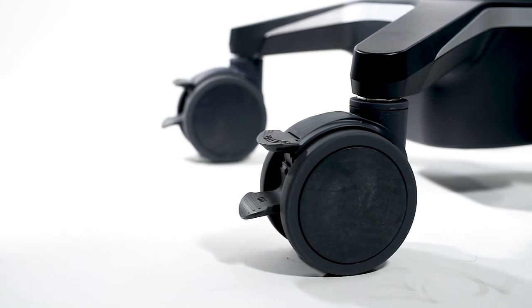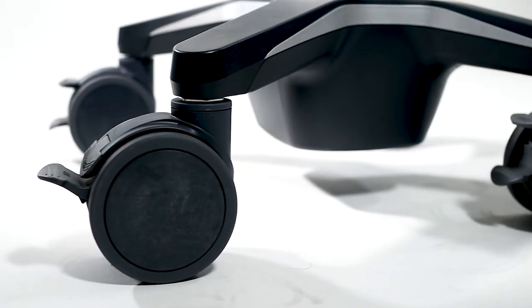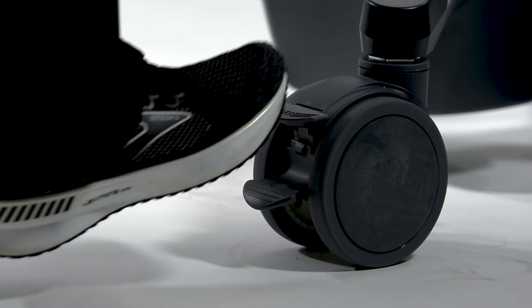To lock the wheels on the cart, press the lever at the top of the wheel. To unlock, lift the same lever on the wheel.